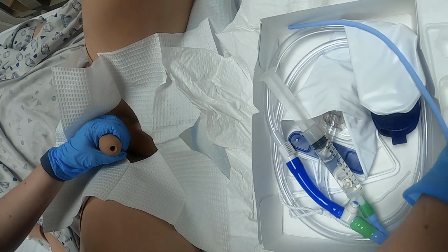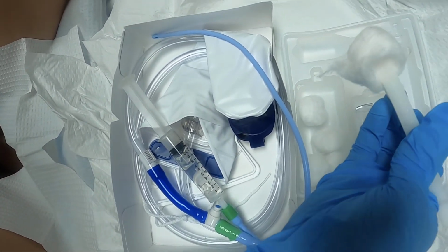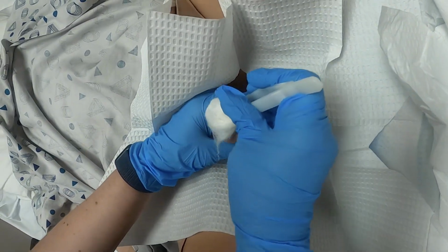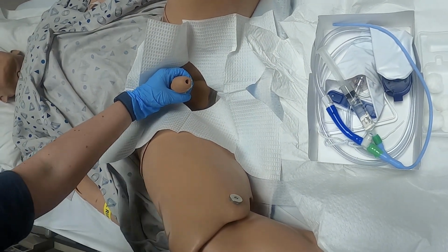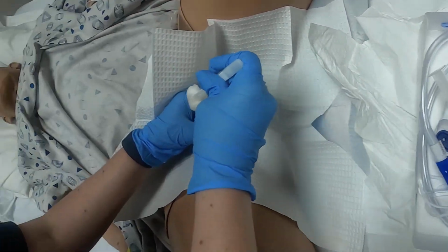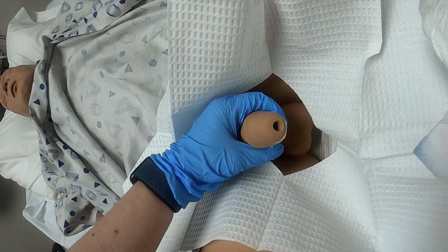Okay, so we're going to take the tweezers, take one cotton ball that is all soaked with betadine, start at the very tip all the way around. There you go, into the trash. Take the next one, make sure that you don't lose it, all the way on the top, and the trash.